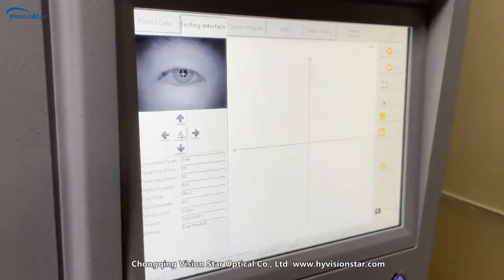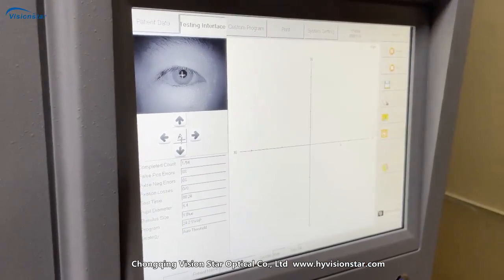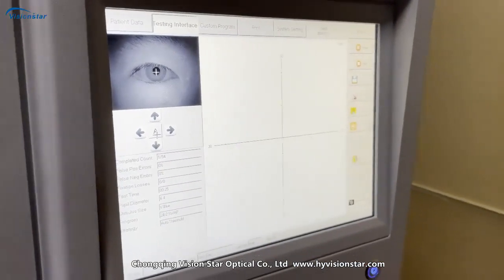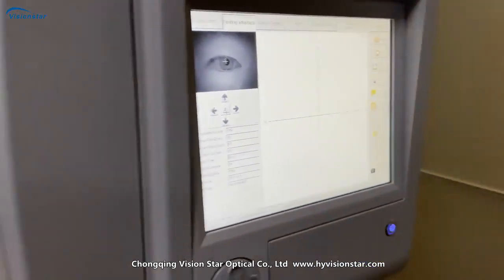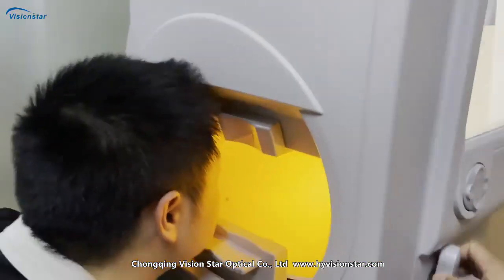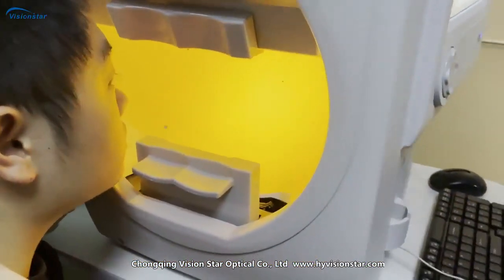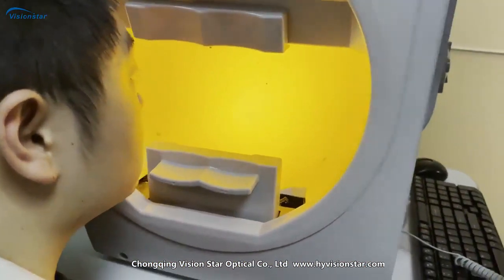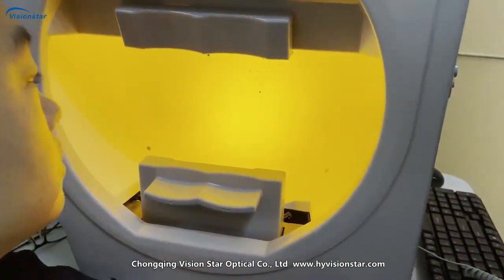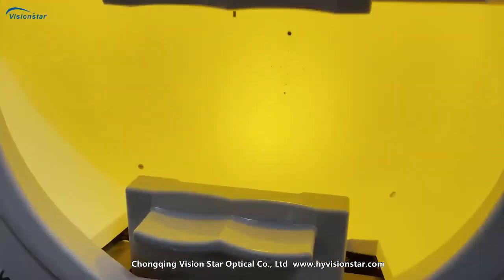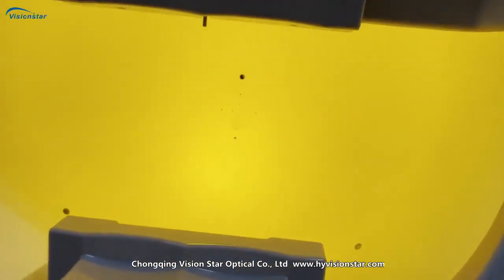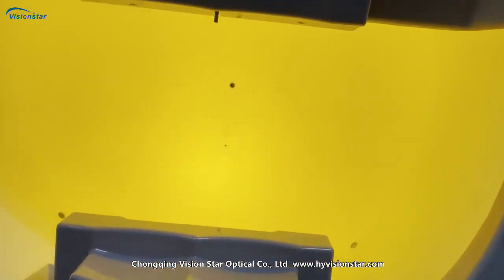Now it's automatic model. Okay, let's see the inside. Look at that. Look at the color bottom.